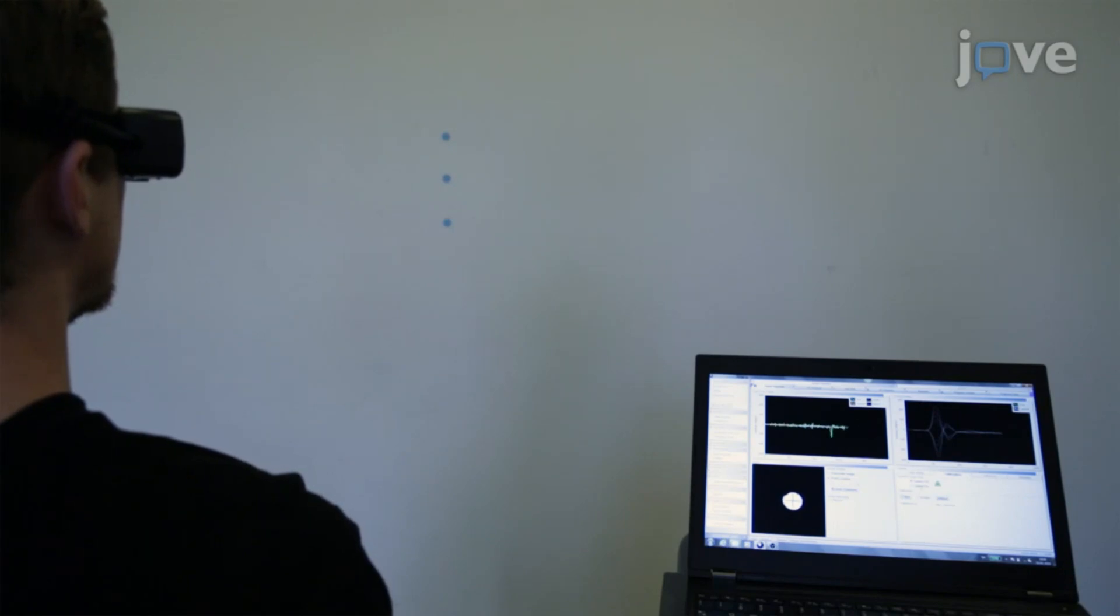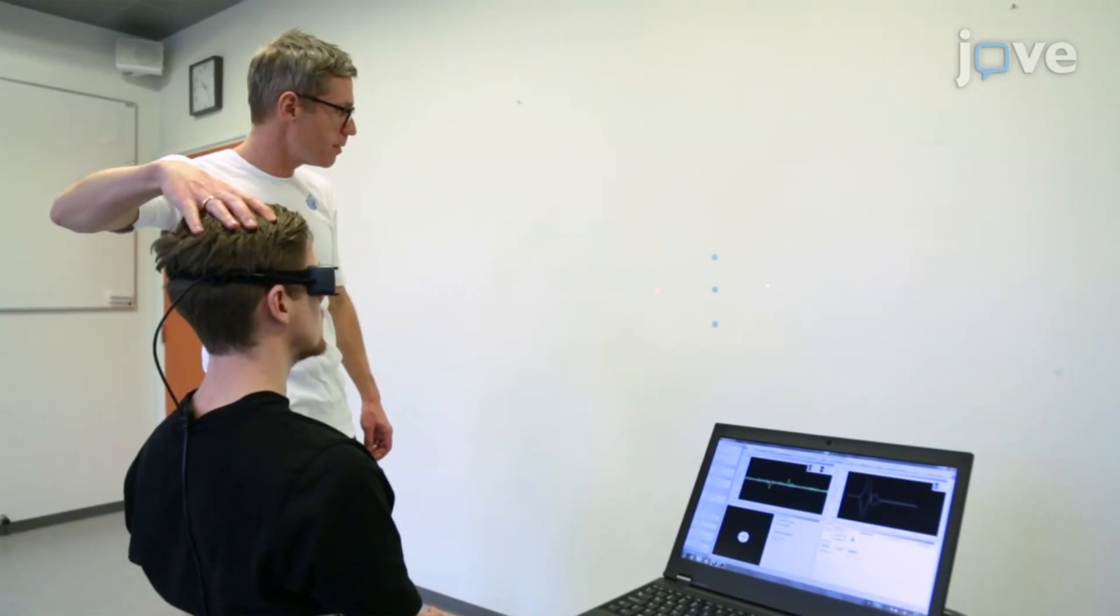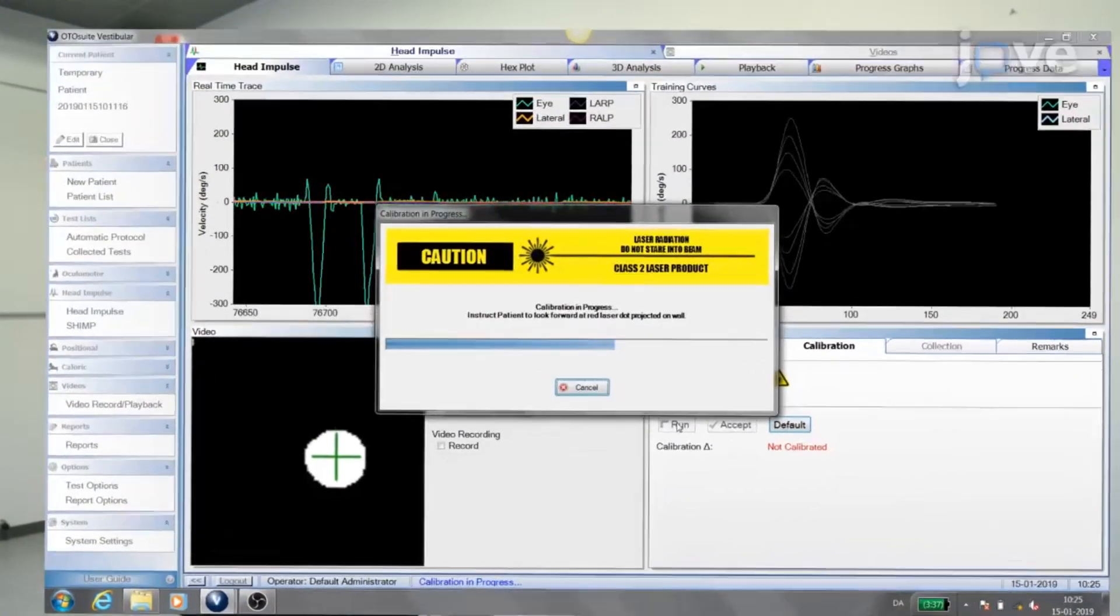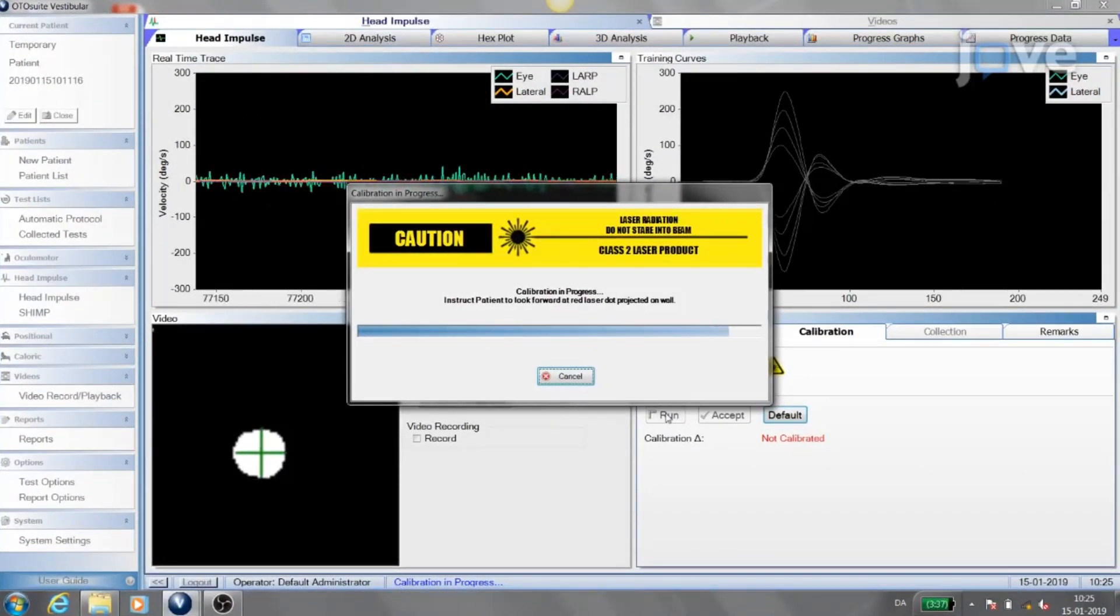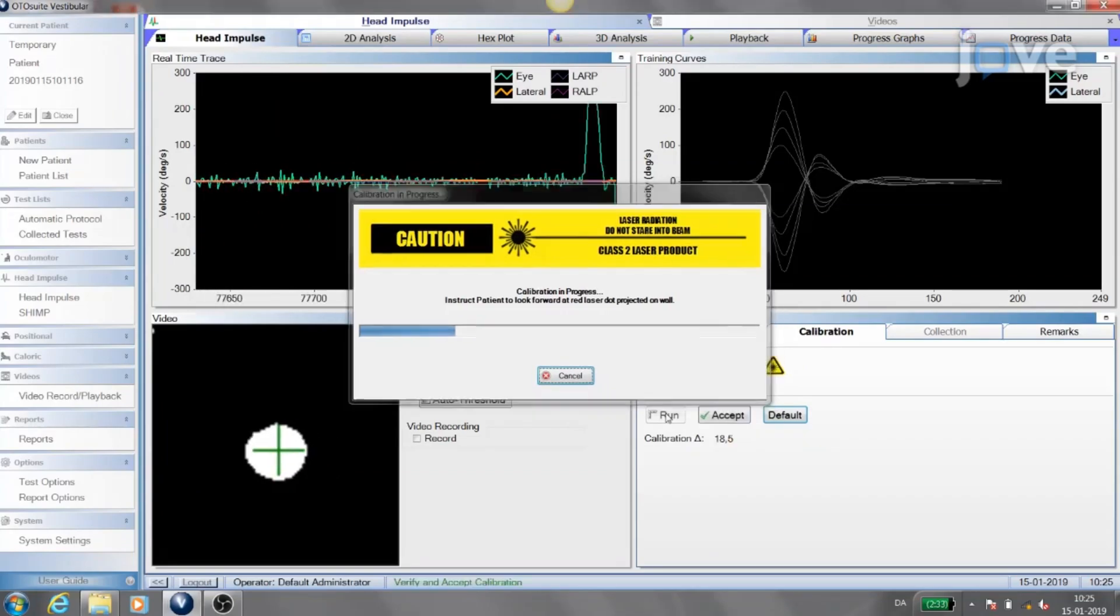For calibration of VHIT system B, first turn the lasers on. Then ask the participant to move their head to position the left and right laser dots on each side of the fixation dot equidistantly. Tell the participant to keep their head in that position, and ask them to follow the visible laser beam dot by moving their eyes only. Check the calibration by having the participant stare at the fixation dot. Move their head side to side about 10 degrees.